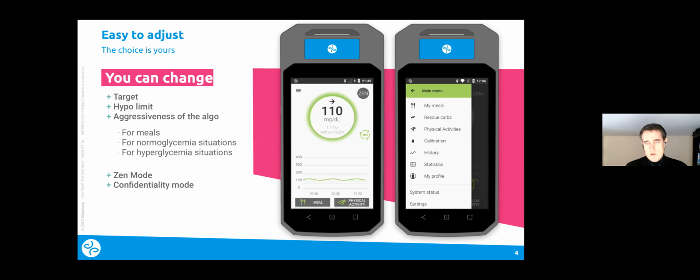You also have a Zen mode that allows you, the system, to say, okay, for the next 3 hours, Mr. System, I've got more important things to do. Just make sure to not bug me at all. I'm driving, kids in the back, it's vacation, I'm not sure what I've eaten. I don't want a hypo, I don't want a rescue carb, I don't want nothing. So it's take it easy.